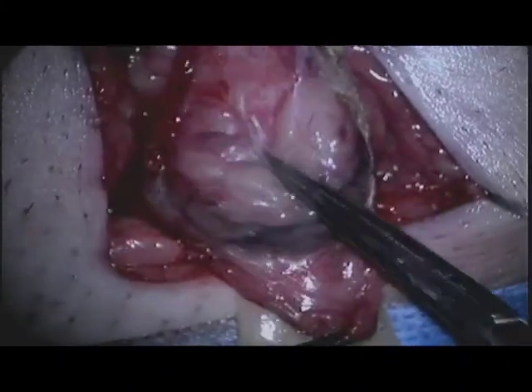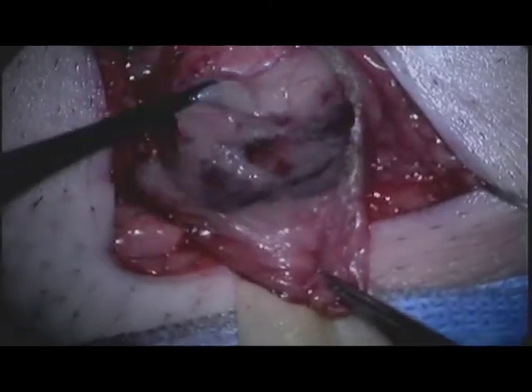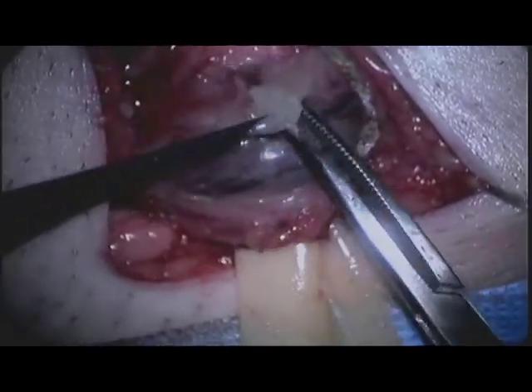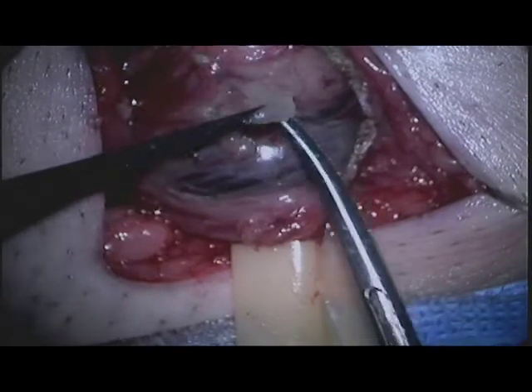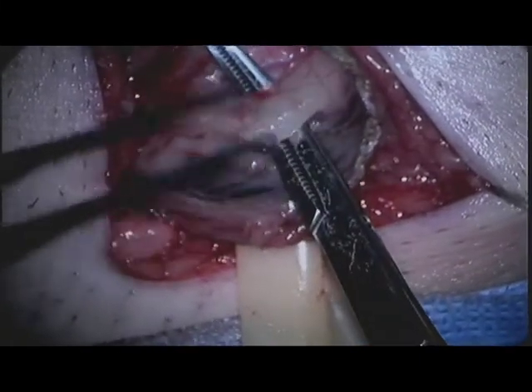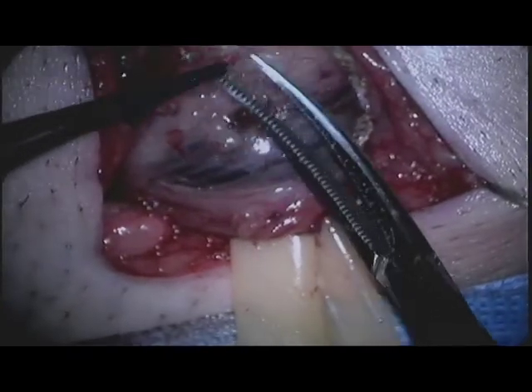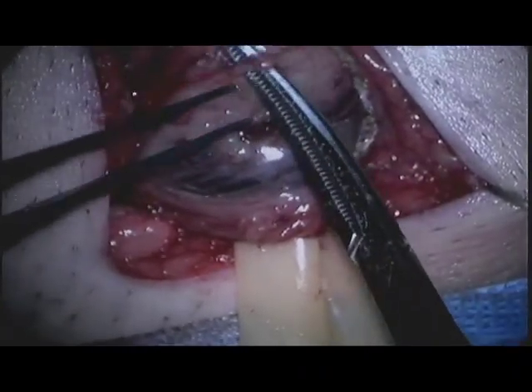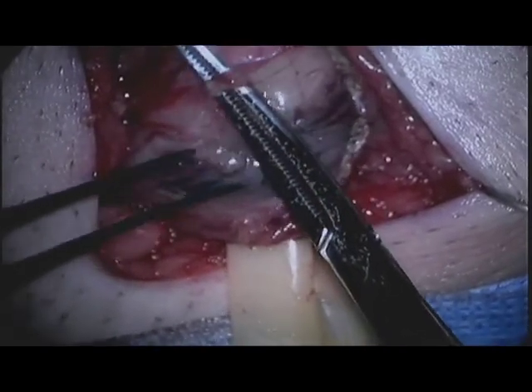We then proceed with our dissection through the spermatic cord contents. Our goal is to identify key structures including the lymphatics, vascular structures, as well as the vas deferens and vasal packet. Our goal is to preserve at least three lymphatic structures as well as the main testicular artery.